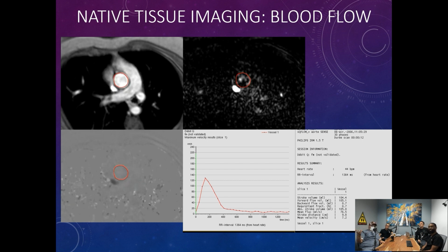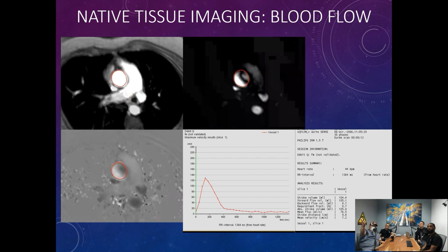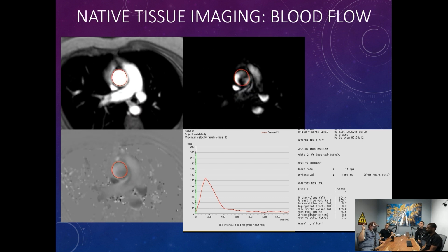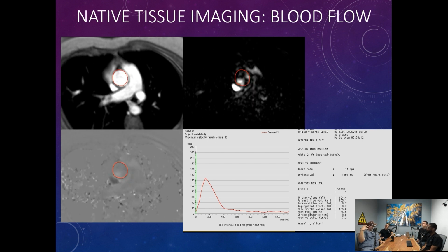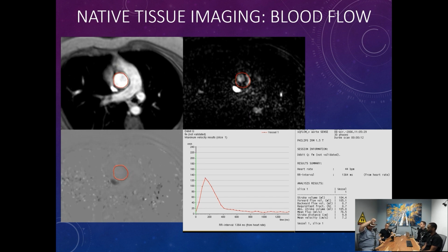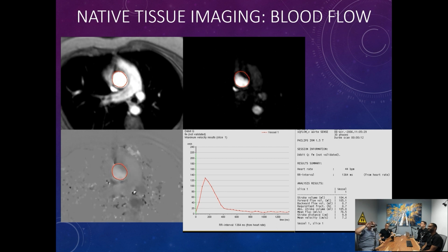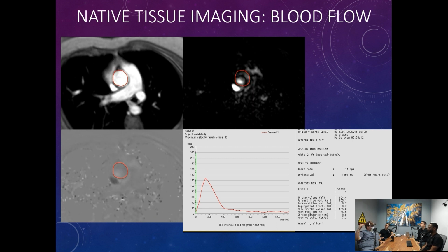For sure. And another thing I will mention too is a weakness of MR compared to echo is when we're using this one-dimensional technique like this, we're setting up an imaging plane and scanning it, but it's not real time. We scan it and then we look at the image. With echo, you've got a probe and you're looking around and you can kind of turn and twist and go like, oh, here's the worst spot, the vena contracta, so-called. Right. And so you can kind of dial in right away on that. With MR, it's kind of like you're chasing your tail. Like, all right, we need to go up a little bit.